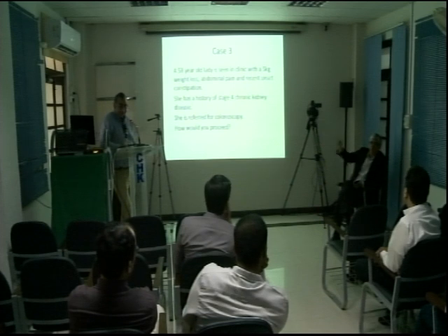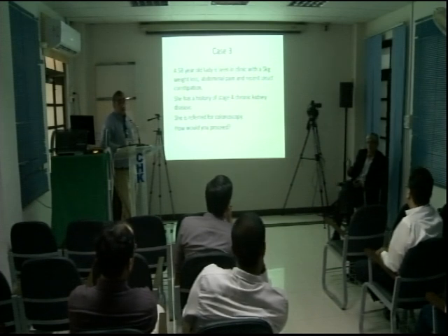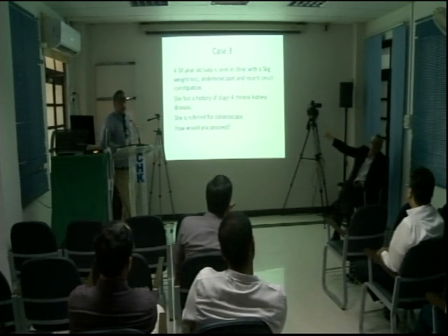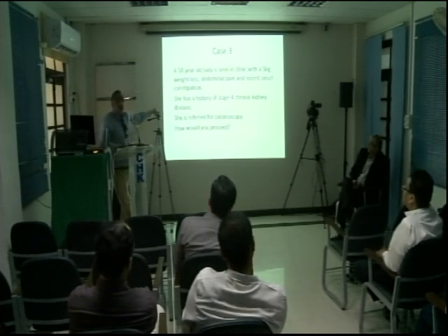One, your bowel prep stops you thinking. So if you do CT colonoscopy, you need bowel prep. You need water, and you need contrast. Number one, it's not a non-invasive procedure. They do put something through the back passage. They have to put in contrast. And in a renal patient, the last thing you want to do is a CT scan. So all radiologists will tell you they won't do it. These are important issues, and you can't dodge them. You have to do it.